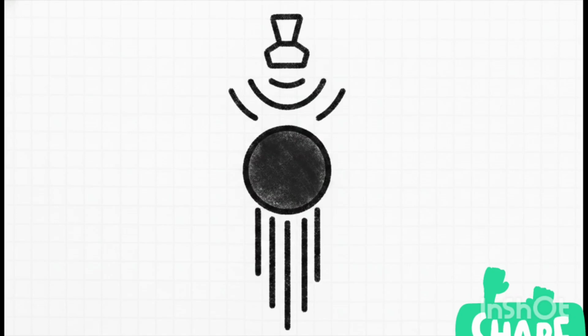But here's the thing. The mass itself isn't your only clue. You gotta look at what's happening right behind it. Because the fibrous tissue of the tumor is so incredibly dense, we frequently see posterior acoustic shadowing. It basically blocks the sound waves like a boulder blocking a stream, creating this distinct dark shadow that drops straight down behind the mass. Solid hypoechoic mass plus a shadow? Yeah, your suspicion should be very high.